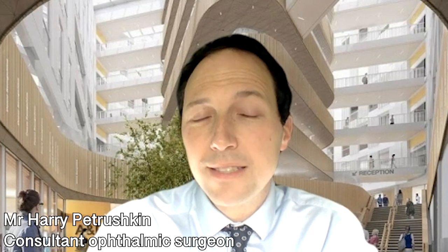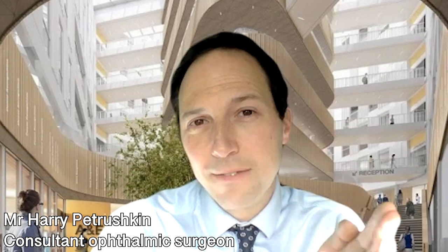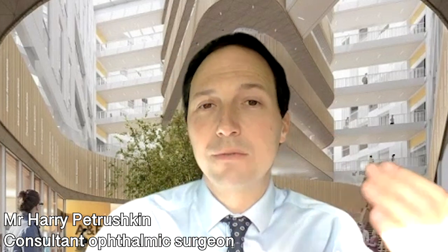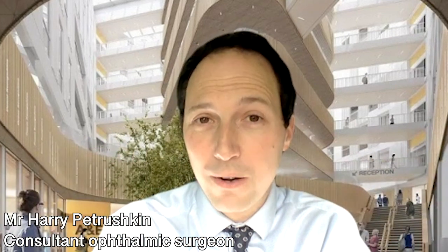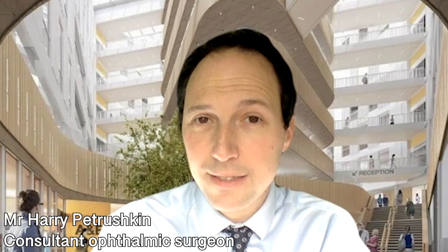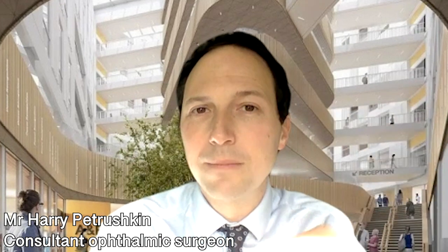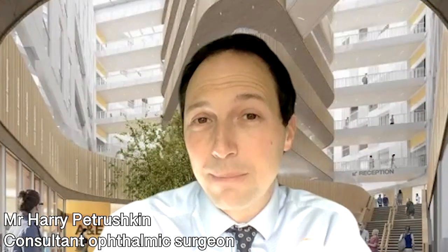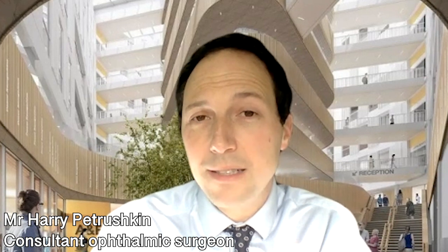So there's a type of vision called monovision, and that's when one eye is set for distance and one eye is set for near. That configuration effectively means that some people can manage well without glasses using monofocal lenses. So those are the lenses that see at specific set distances. You'd want to try that before you had the lens implanted inside your eye, because some people love it and some people, it doesn't suit them.